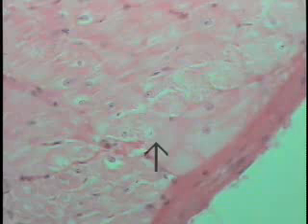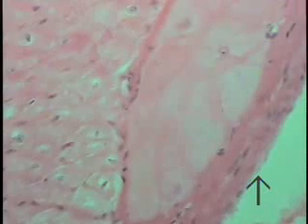Once again, these Purkinje cells are several times the size of ordinary cardiac muscle cells. We're just tracing the endocardium. You can see it's pretty similar all the way along its length, and just to demonstrate once again, another small bundle of Purkinje cells. These are conducting fibers that conduct the impulses. You can see they're located with considerable abundance.